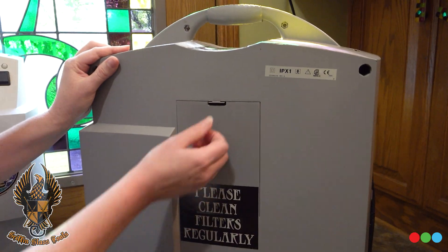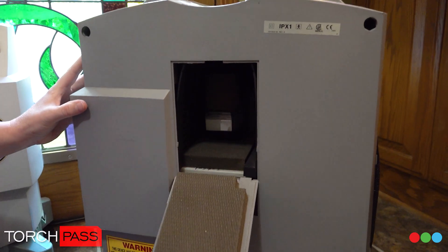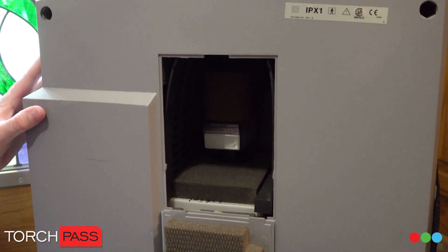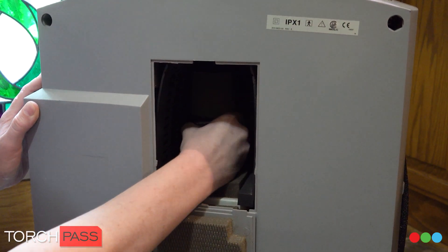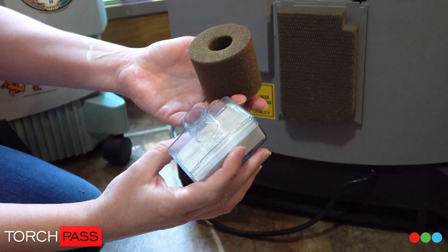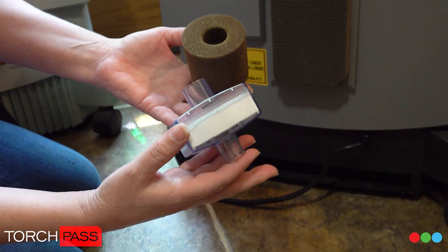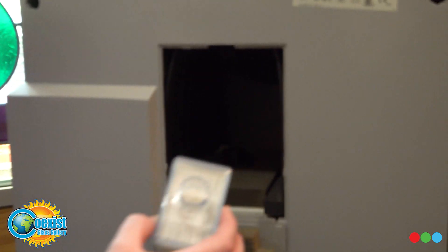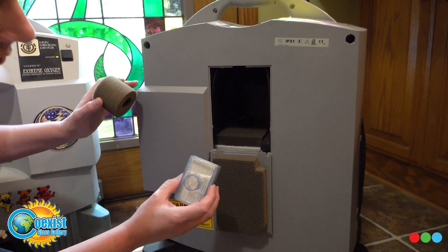All machines have a version of this back filter — some might be different, some more rectangular. Go ahead and pull that out, just give it a twist and pull that up. That's what's going to be in there — something like this, depends on the model you have. That's the filter, it's got a piece that goes on top and then it just slides right in. Let's see if we can get a look in there — it's dark, there's just a hole, essentially a cavity.